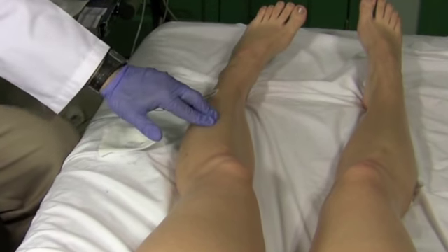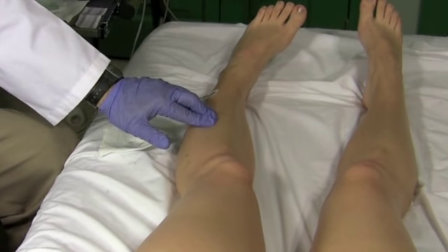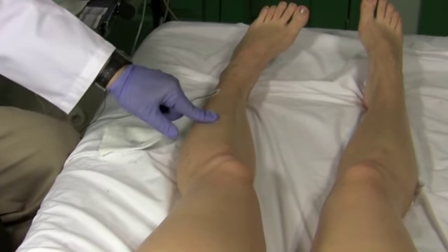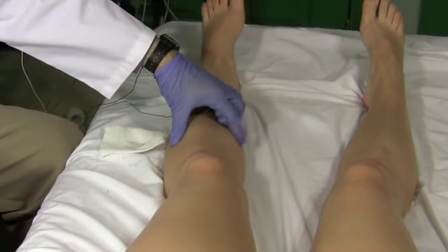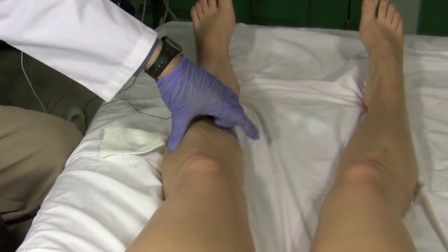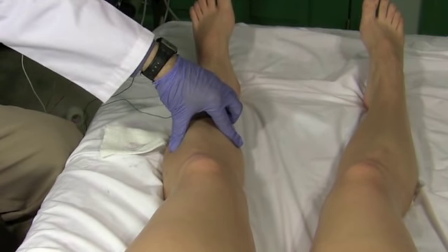Then we do the tibialis anterior. That's another peroneal innervated muscle, but it's in the L4-5 distribution. And then we do the medial gastroc, which is a tibial innervated muscle, primarily S1 and S2.